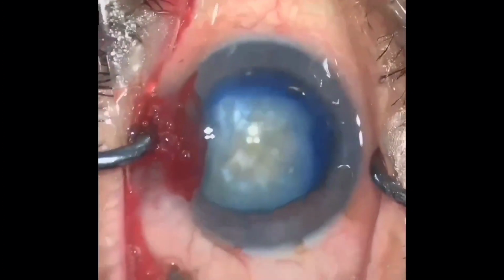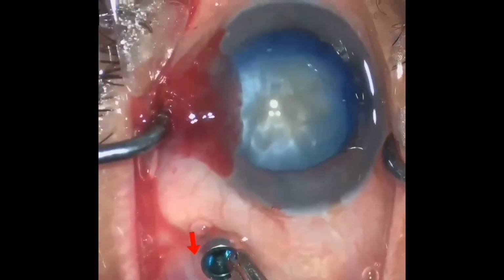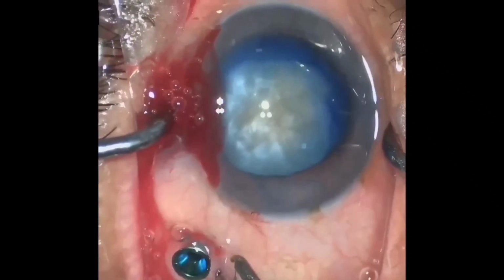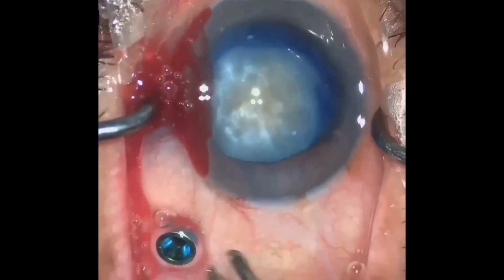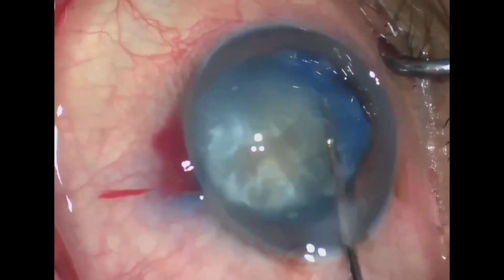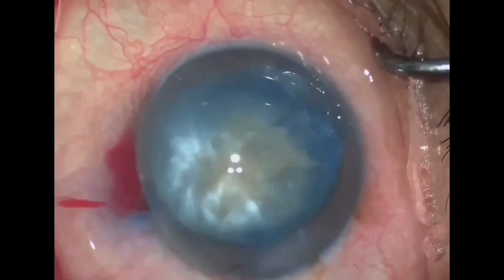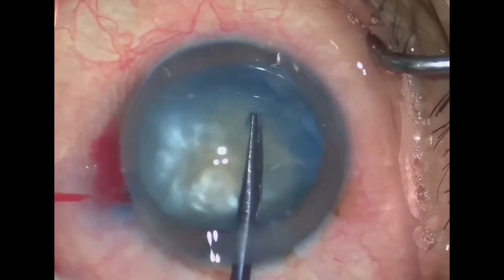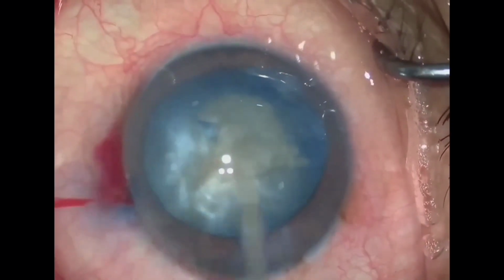This was followed by egress of the blue tinged fluid, which is suggestive of fluid in the retrolenticular space. This was followed by the deepening of the anterior chamber. Viscoelastic was again injected and the capsule was cut with micro scissors near the point of extension. Rhexis was started with rhexis forceps.